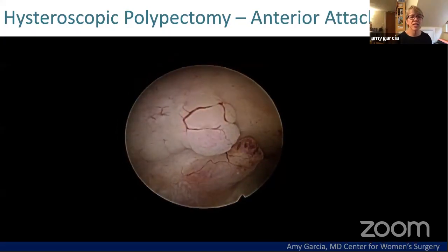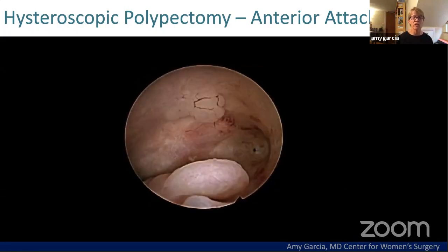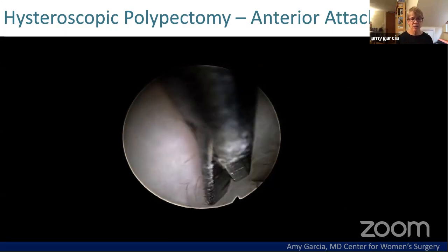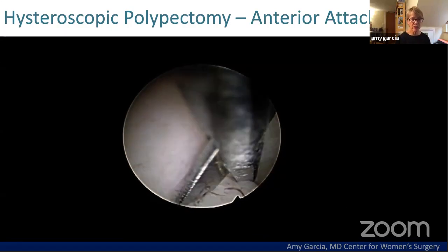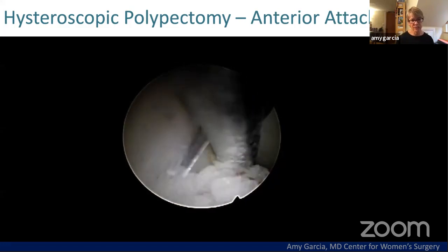This is the still that I showed you earlier. This is a postmenopausal patient. This is an adenocarcinoma, turns out to be, with multiple benign polyps. She did have postmenopausal bleeding. She also has uterine atrophy that was hemorrhagic. So she has a number of issues.